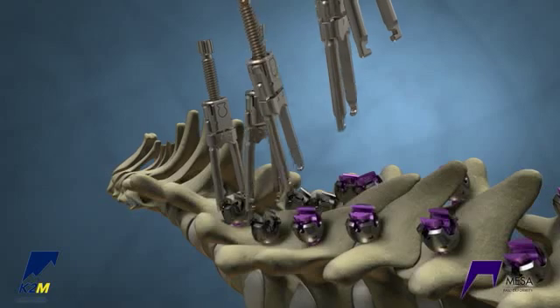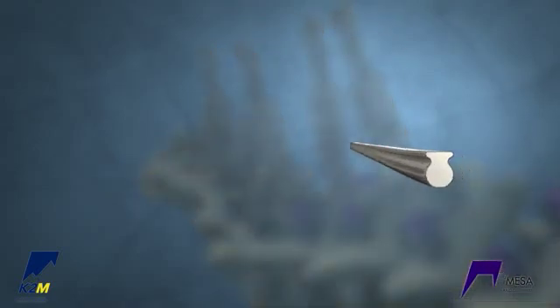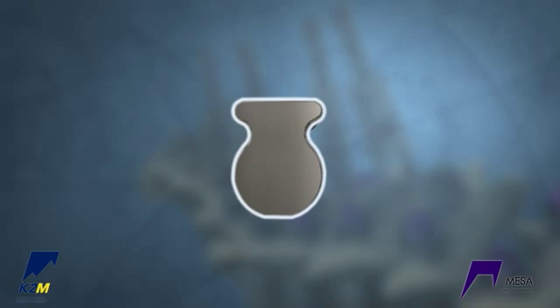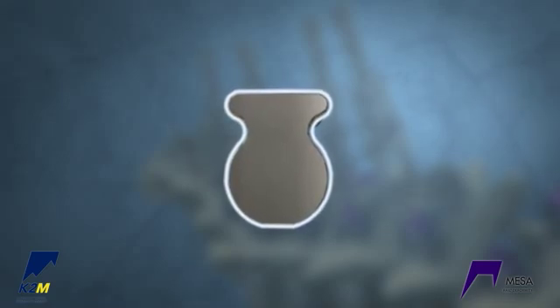Place the Deformity Rail crickets on the upper part of the concave side of the curve. Due to the inherent beam-like design, the rail provides enhanced rigidity and strength to aid in the restoration of thoracic kyphosis, while maintaining a low profile.